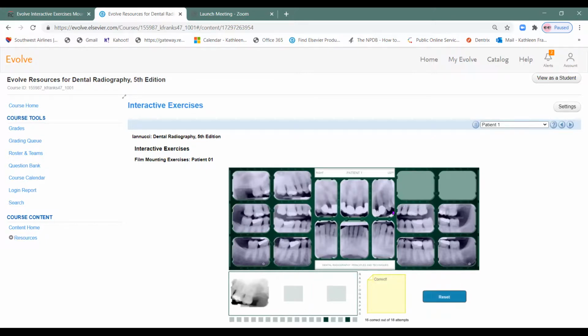It goes along with this bridge that this patient has. Looks like it's from canine to canine. And you can kind of tell it's a canine shot because, first of all, it's not straight on. I don't know if you remember when I talked about taking your canine on the maxillary because of the way that your mouth turns at that canine, right? That you're not going to get a good straight on shot like you do with the centrals.